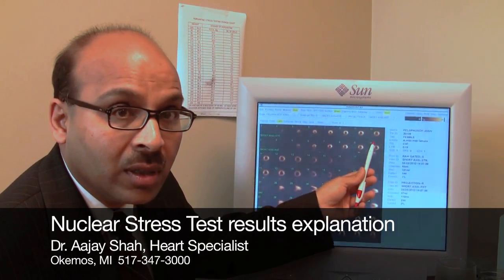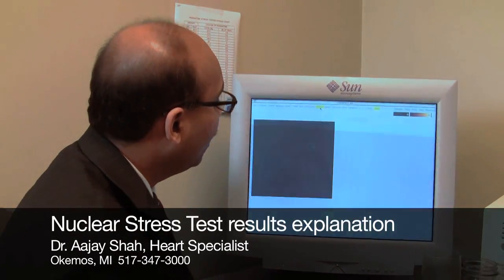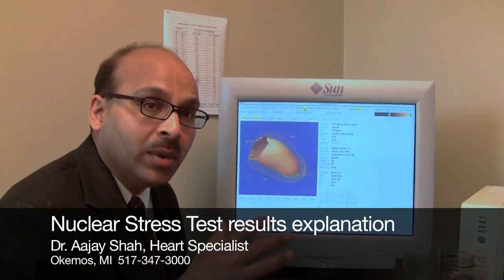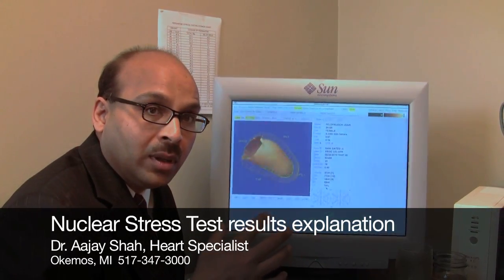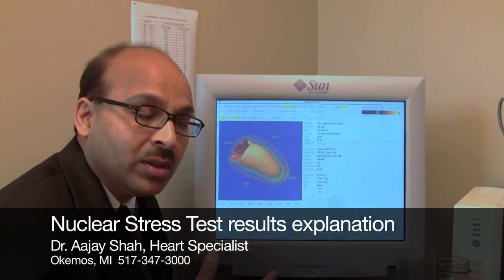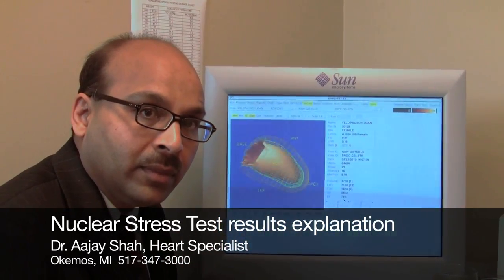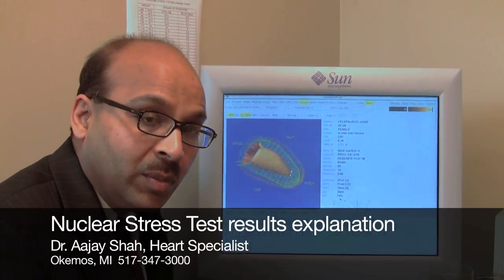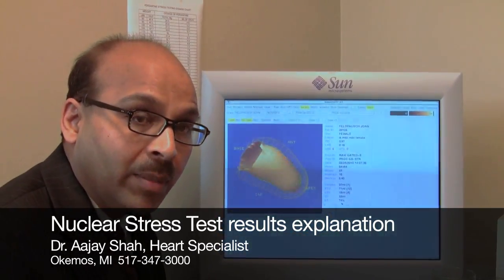Essentially, these are the nuclear results — relatively simple. I'll also show you how heart function is measured. Here's your heart where we take a picture while it's contracting. Looking at it, and also by computer, we get a number called ejection fraction — which is essentially the ratio of the amount of blood leaving the heart to the amount of blood entering the heart. The normal ejection fraction is between 50 and 70%. In this person's case, they happen to be around 70–75%, which is very normal.